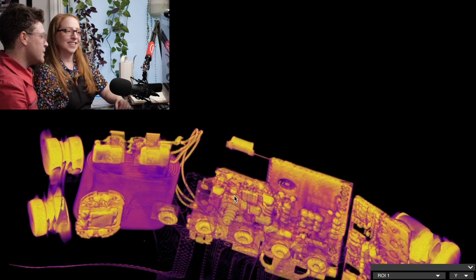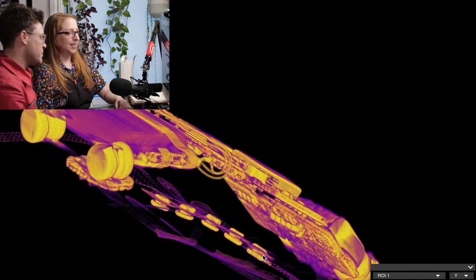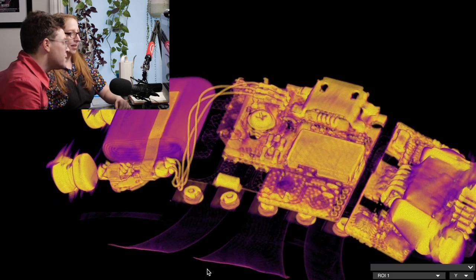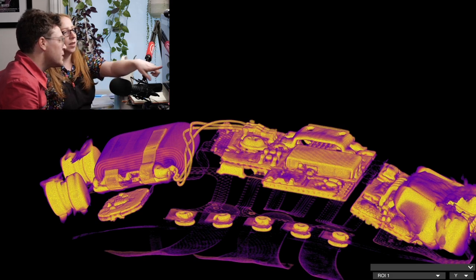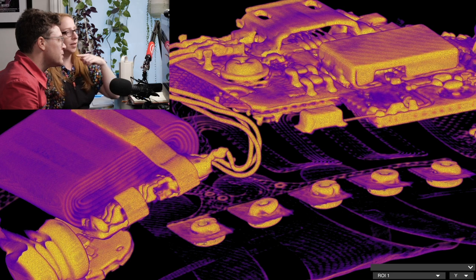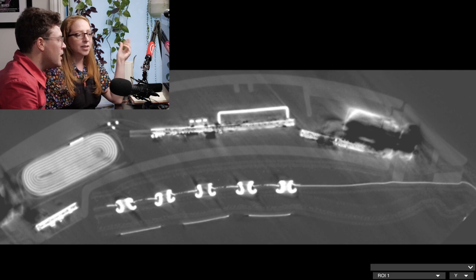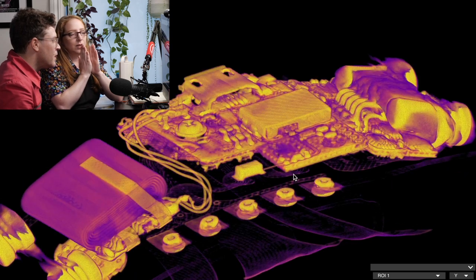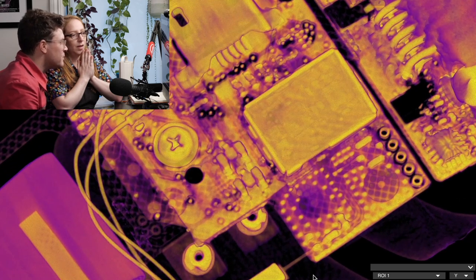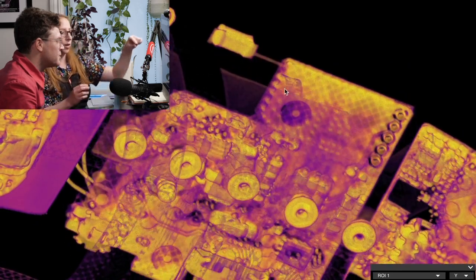The CT scan was taken with the main unit clipped in, so you can see both magnets. There's the pulse oximeter board, and down in the fabric area — those aren't test points, those are where the fabric joins the flex PCB. It's rivets! That makes sense because you can use a rivet to make good electrical contact between the conductive fabric and the flex PCB. You can totally see that from the CT scan — it's a rivet joining the fabric to the flex PCB.